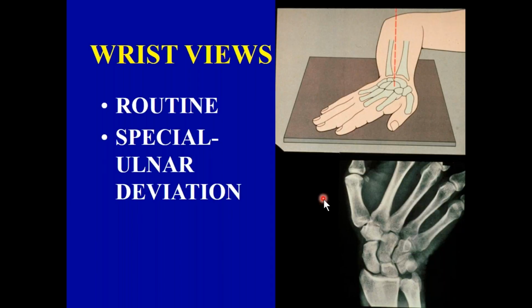So now the doctor says, I want a wrist x-ray, but leave the collimation open so that I see the distal end of the fingers. Well, he's putting himself in a bit of a quandary because this is always going to be too dark, because you took a measurement for the wrist examination. So it's not that you're doing things incorrectly, it's just that the information the doctor is seeing, if he doesn't have a hot light to see the dark areas, he can't make decisions about small little fractures.